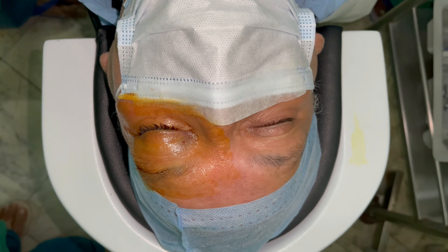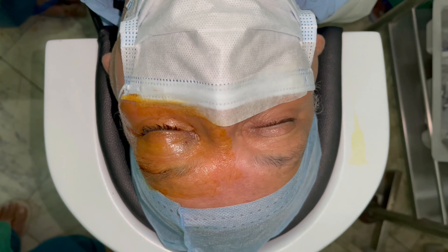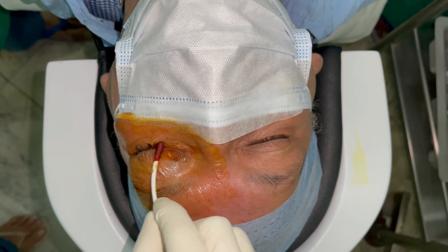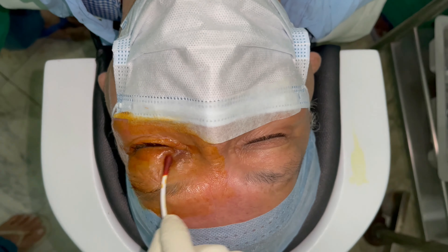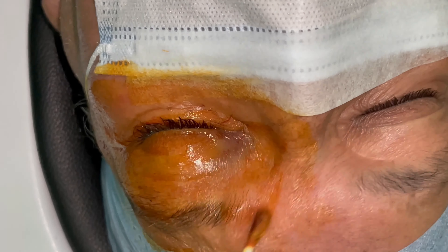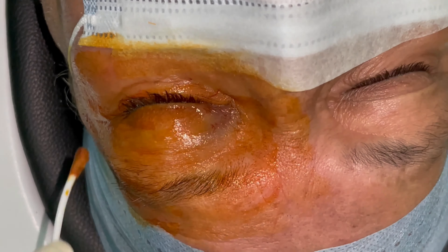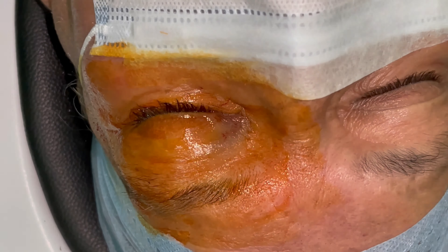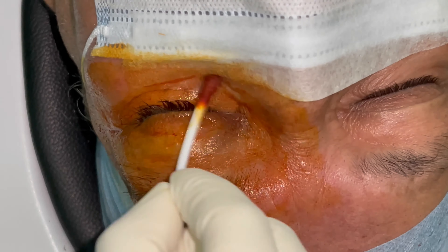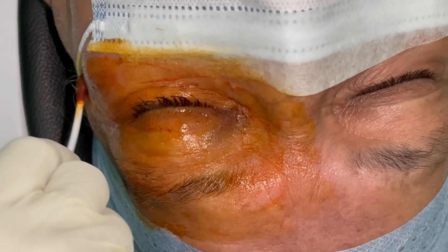We now proceed with cleaning the eye with betadine, as demonstrated below. The surgeon uses betadine on a cotton bud and cleans first the area of the lid margins, then moves to the area above — up to the brow and up to the exposed part of the forehead. The same procedure is then carried out inferiorly, where the lower lid margin is cleaned first, followed by the rest of the exposed lower part of the face.